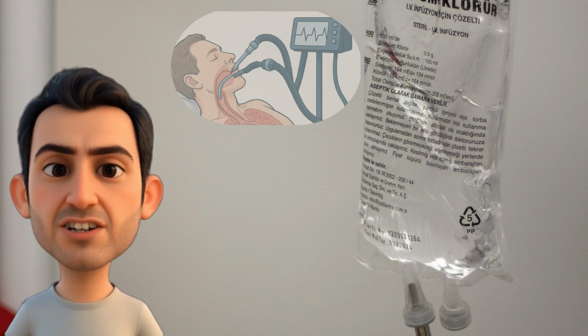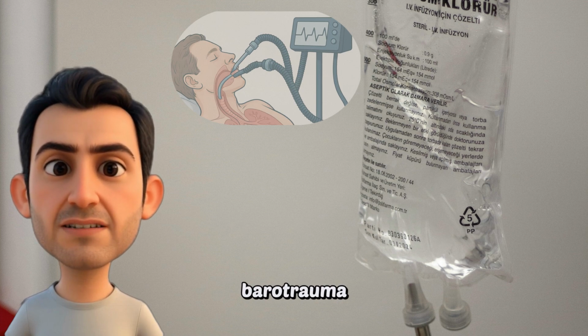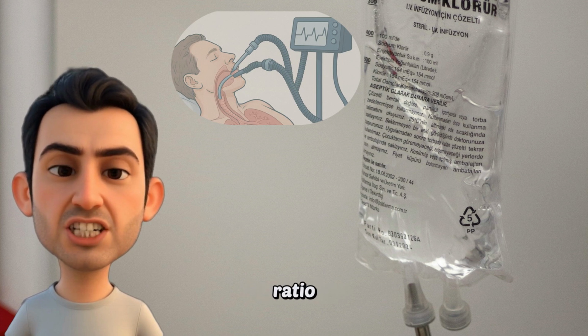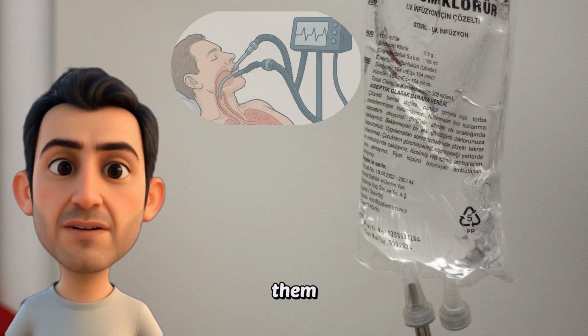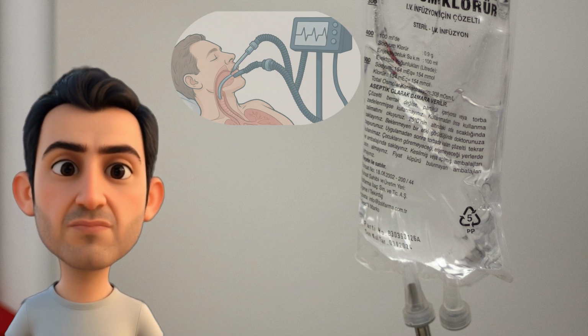Keep your plateau pressure under 30 to avoid barotrauma. And your inspiratory to expiratory ratio, start at 1 to 2. For asthma or COPD, give them more time to breathe out. Use a ratio of 1 to 4.